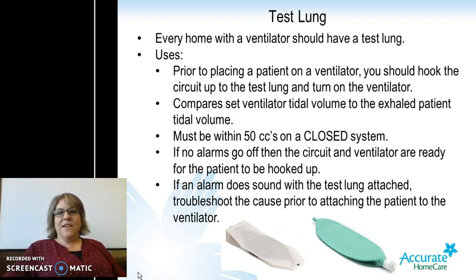Every home will have a test lung in it. It could either be the hard plastic one right here, either a light blue or a clear or white, or it can be a soft-sided one like pictured here, which is like a green or a gray color.